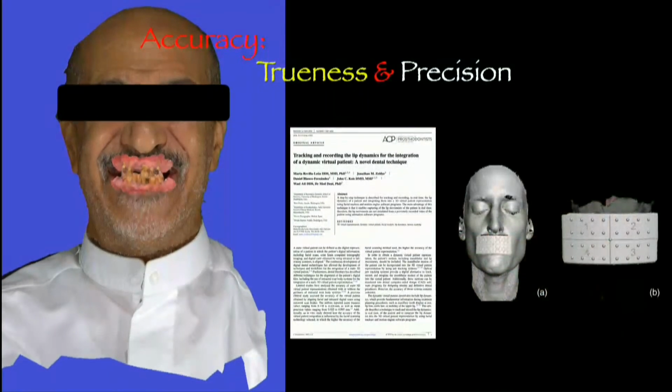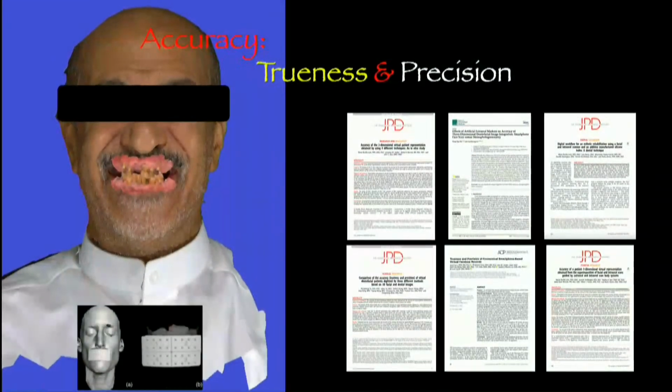So a lot of authors suggested using extraoral scan body systems basically to facilitate that merging process. Think about this as a translator between both files. For this, we do have data, we do have evidence. Now, no one even bothered to do a study about direct alignment between those two files because it's simply inaccurate. It doesn't make sense. It's probably one of the most inaccurate things to do in dentistry. So for this, we do have evidence, and we do have some pretty recent ones. A couple of them are not published yet, and inshallah, they will be published next year.